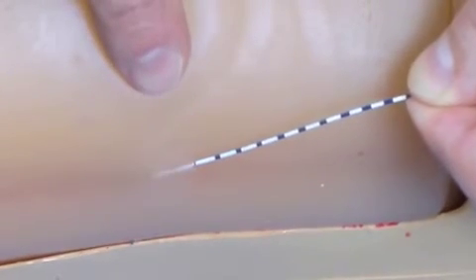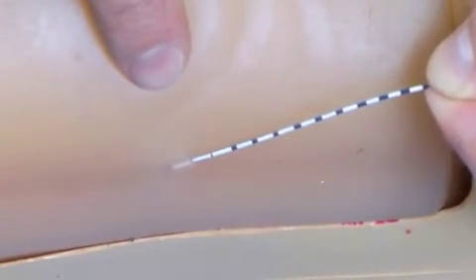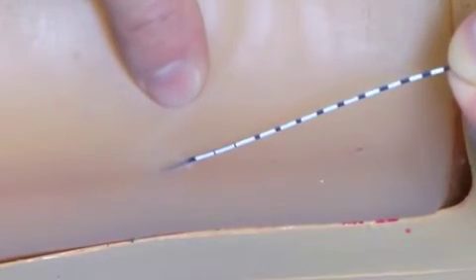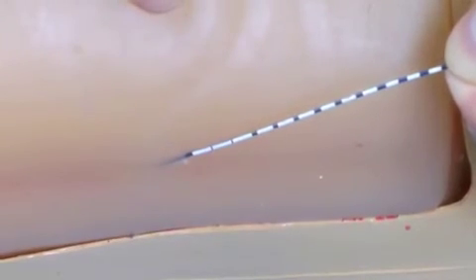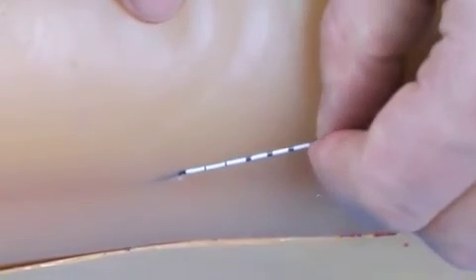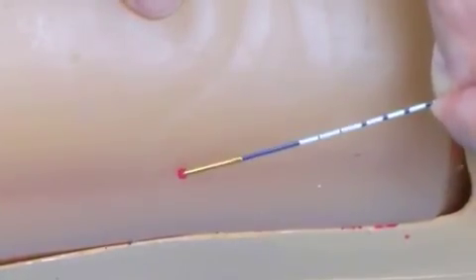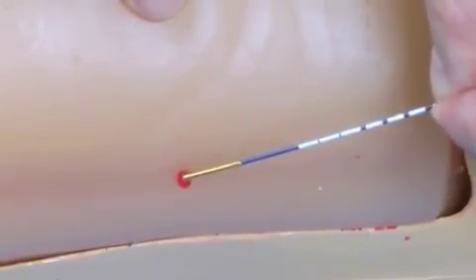In a normal patient, we get to the pullback section where we see the confluence of the white marks, and as we can see these three in a row, and it starts going blue afterwards, we would stop at this point. When we withdraw the fibre, we can see that we've got about three centimetres left deep inside.